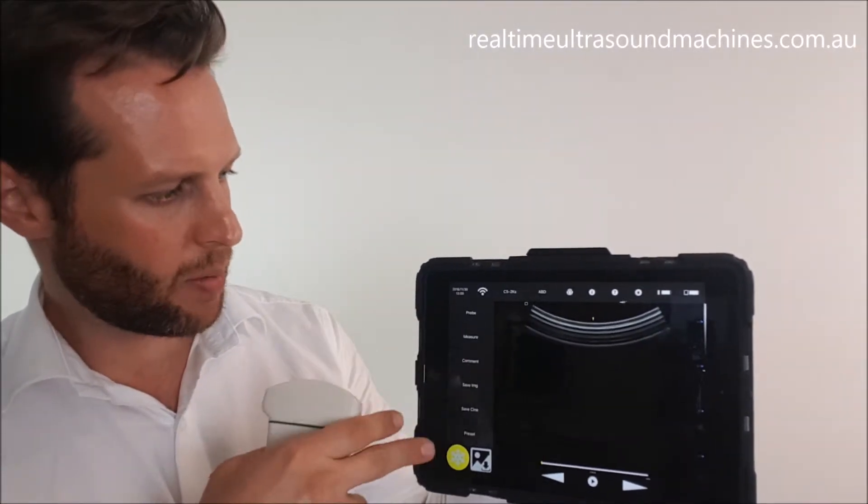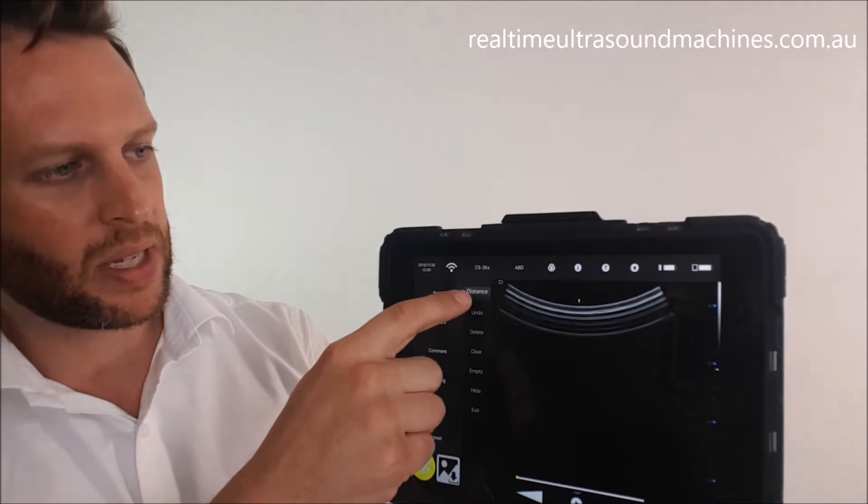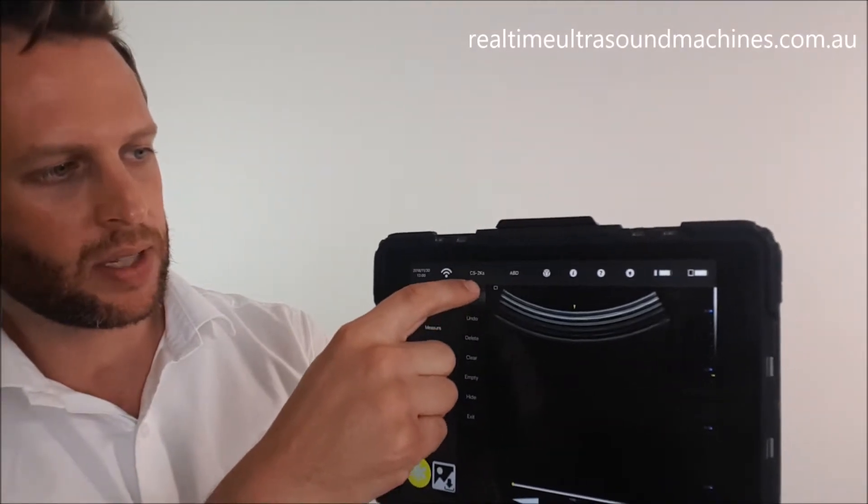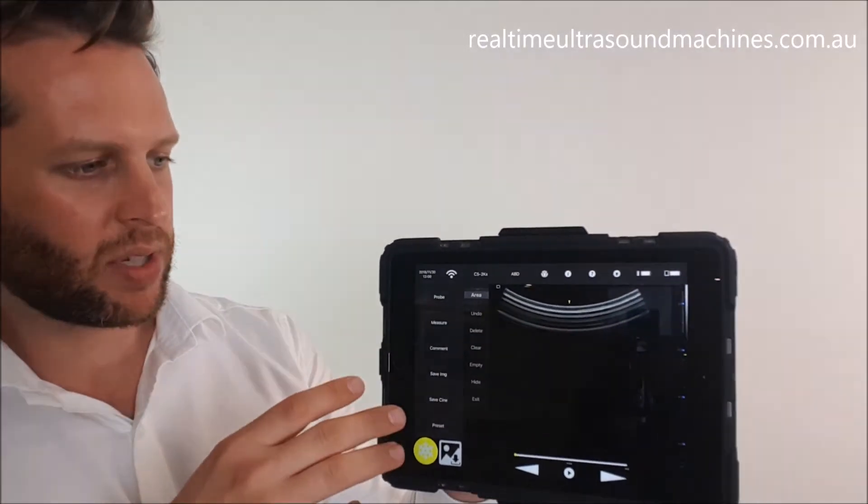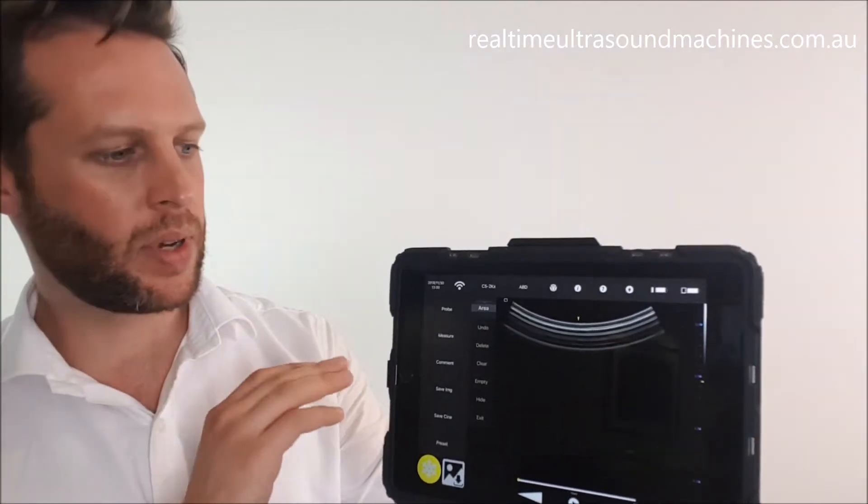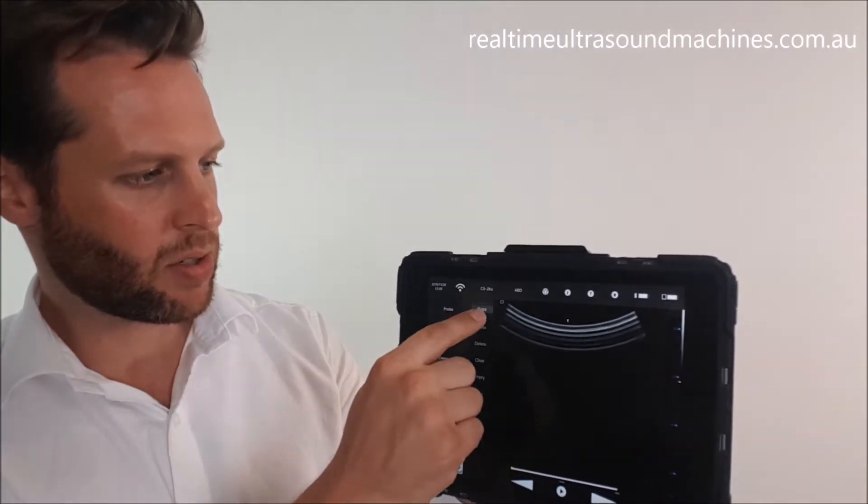Now if I want to do a measurement, I'm just going to hit measure. It'll bring up some options: distance, angle, and area. It's a little more scaled down on mobile devices like Android and iOS compared to the Windows software. In the Windows software, you have a lot more measurement options, but here we've just got those three.